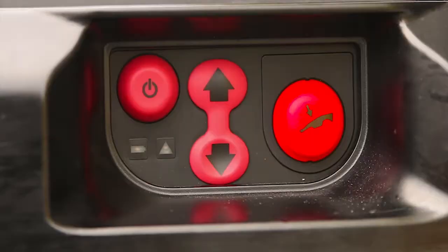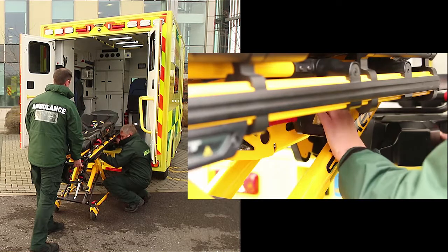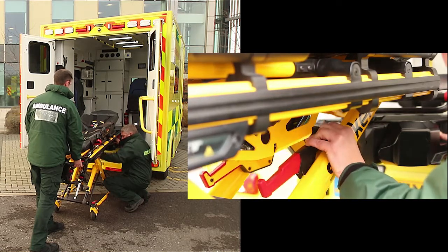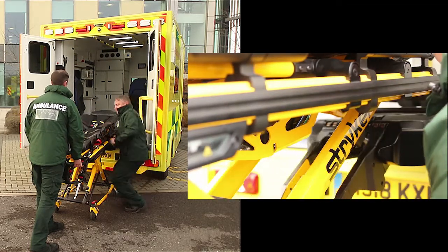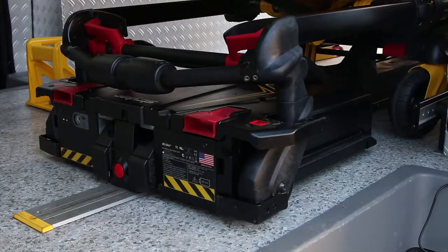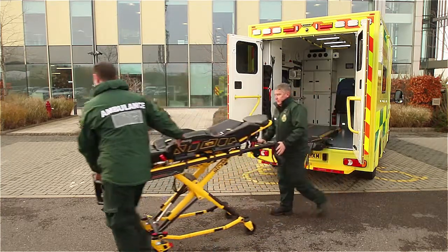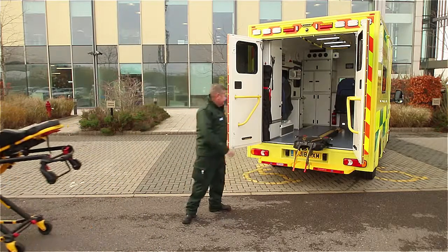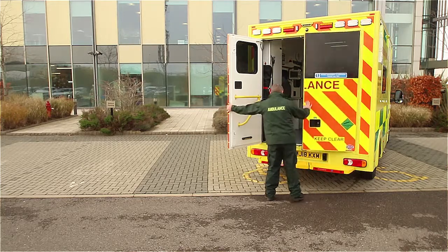Press and hold the plus button to extend the legs of the stretcher until they touch the ground. Firmly press the lifting arms manual release button on the PowerLoad control panel to release pressure in the hydraulics. At this point the cot will not drop, but the operator should be ready to support the stretcher. You can apply pressure to the lifting arms to help the hydraulics release while pressing the manual release button. Lift the red manual backup release handle on the PowerLoad to unlock the stretcher. You can then raise the lifting arms and guide the PowerLoad into the vehicle to close the ambulance doors.